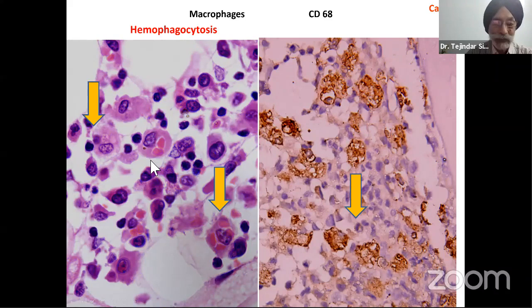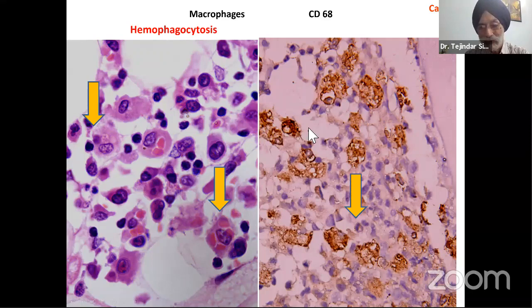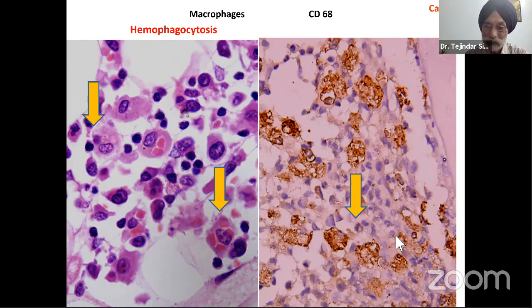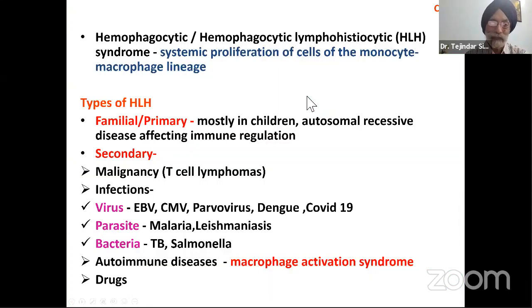The macrophages did show hemophagocytosis. This is a slide from another case where we came across hemophagocytosis, but on the bone marrow trephine biopsy the macrophages were not as clearly seen. To confirm, we carried out CD68 staining. This CD68 stain is showing a marked increase in macrophages, and some of the macrophages are showing hemophagocytosis. So the diagnosis is a case of hemophagocytosis. Are we dealing with HLH — hemophagocytic lymphohistiocytosis?